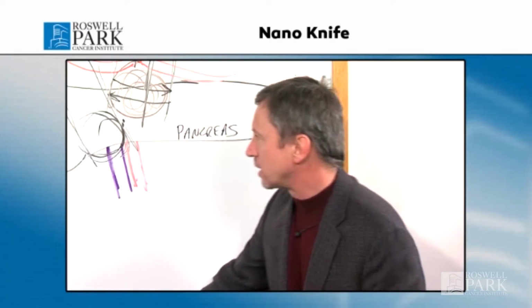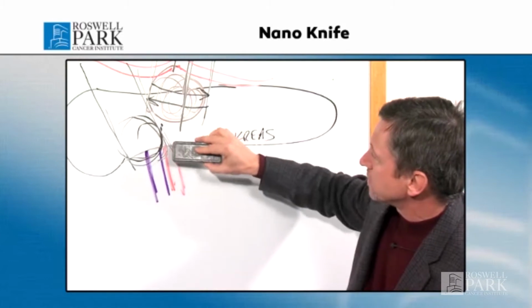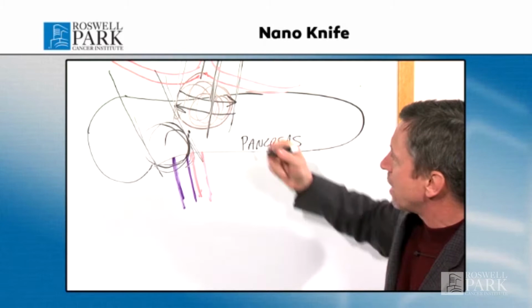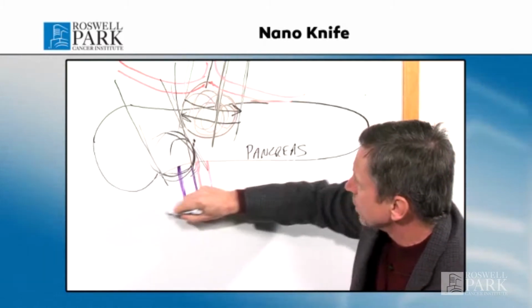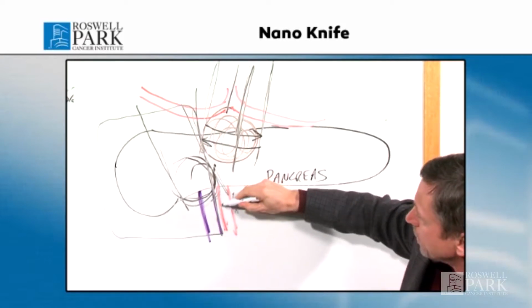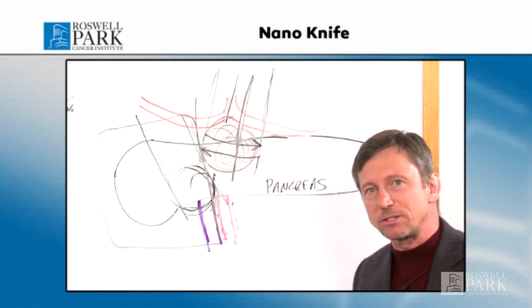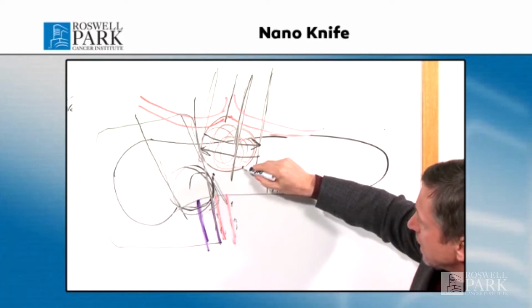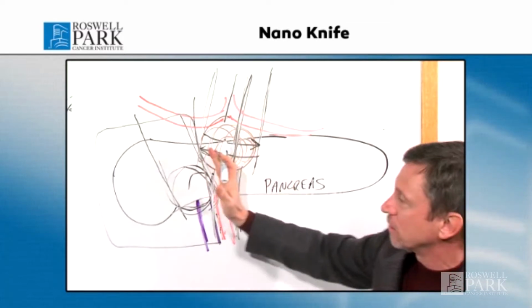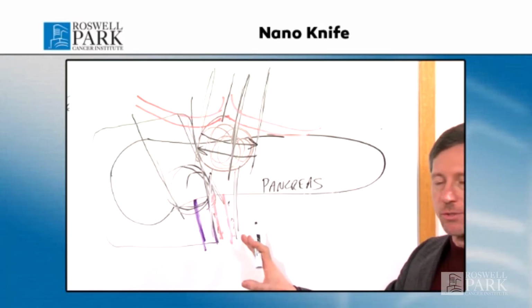There's one other indication for a situation where you have a tumor like this that's up against the major blood vessels. As opposed to taking the tumor out, for example, doing a Whipple procedure and removing the head of the pancreas where we might be leaving tumor cells behind on the blood vessel, you can use the NanoKnife in addition to surgery to kill the tumor cells that might be on the artery, but then go ahead and remove the tumor. So this would be something that's done in addition to surgery.